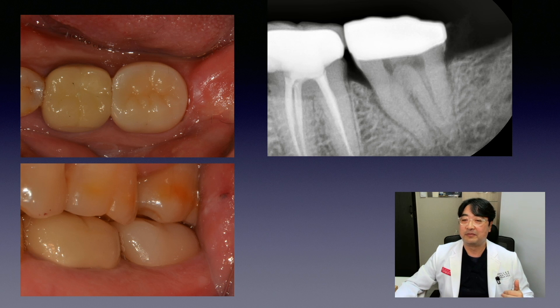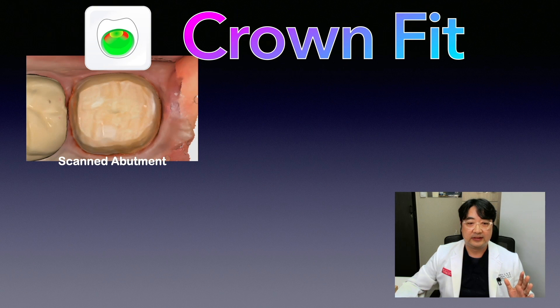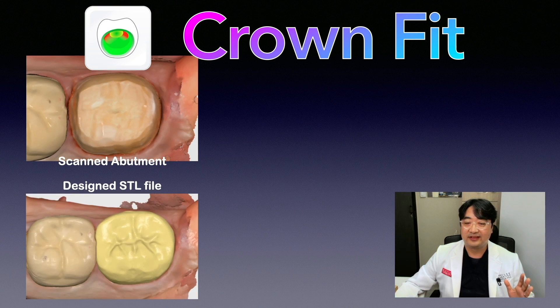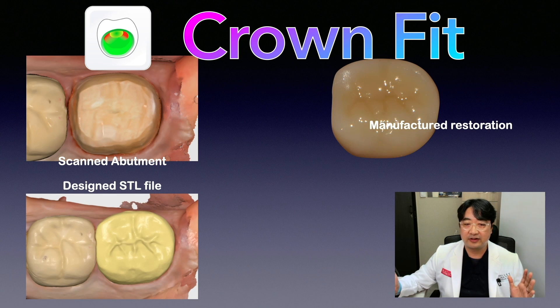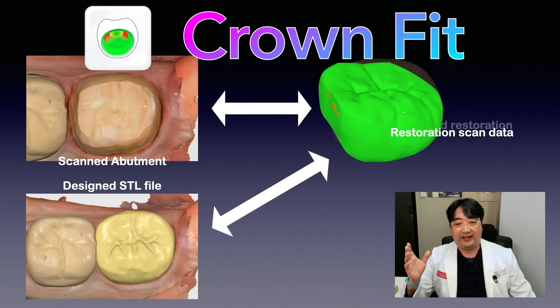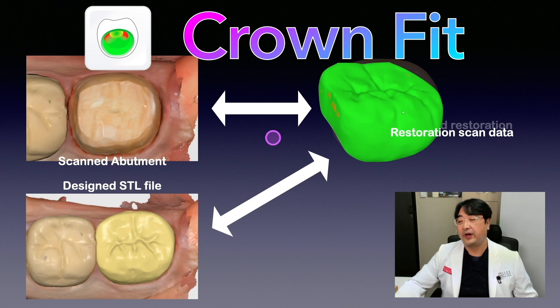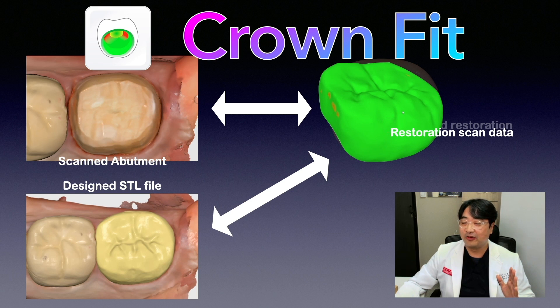So again, this is what CrownFit does. We have the scanned abutment, the designed STL file, and the manufactured real crown. We scan the real crown with the i500. With CrownFit, you can compare the STL and the crown to see the accuracy of manufacturing, and also compare the abutment tooth to the internal surface of the crown to assess how good the fit is.